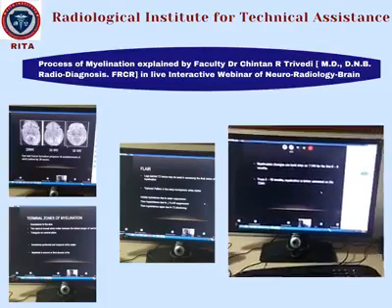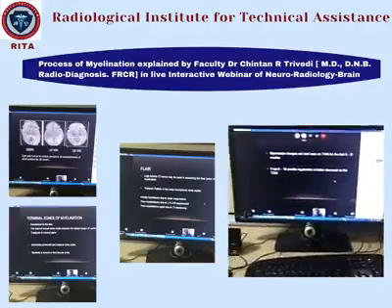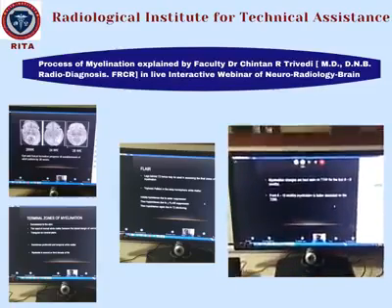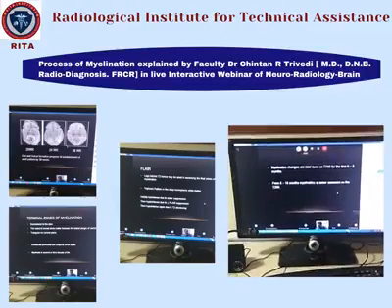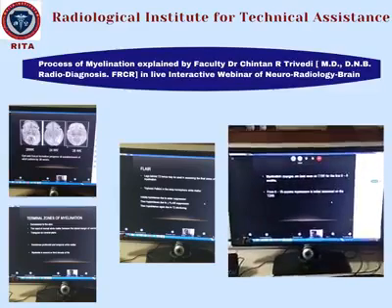So best seen at 0 to 6 months of age is on the T1 weighted images. Up to 1 year, actually 6 to 8 months is the best time, but up to 1 year you will see these changes of myelination on T1. On T2 there is a lag. So even though it is myelinated appearing on T1, on T2 there may be a 1 to 2 months lag.